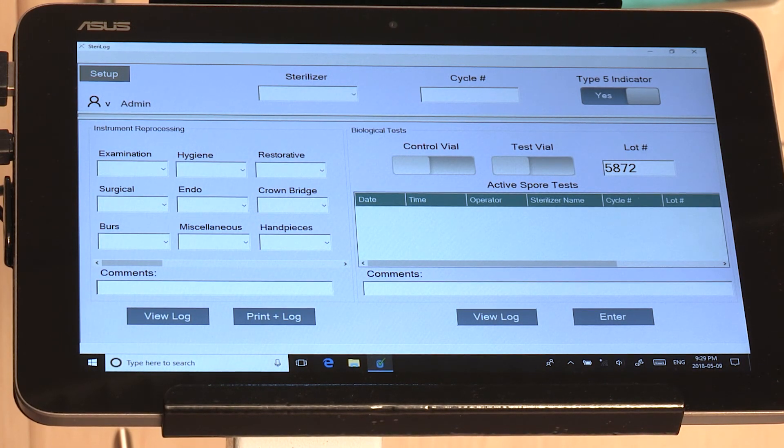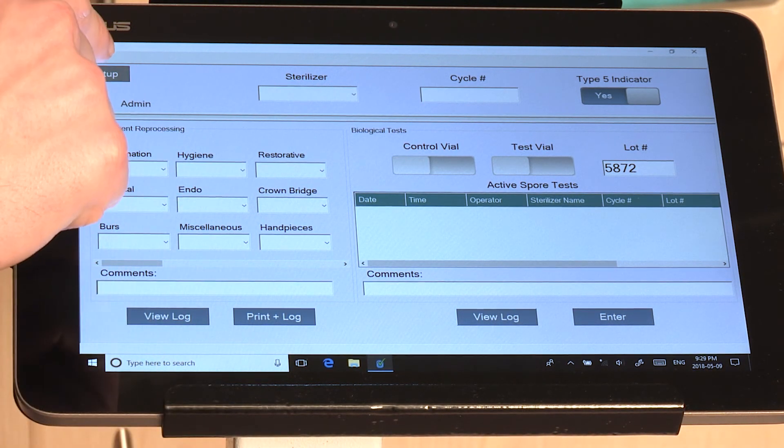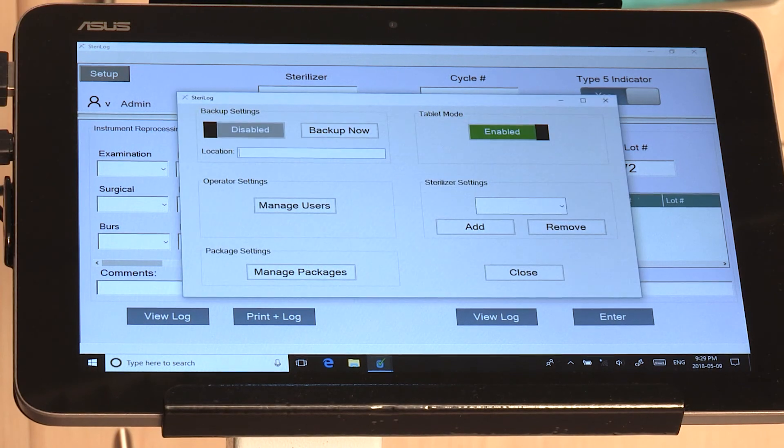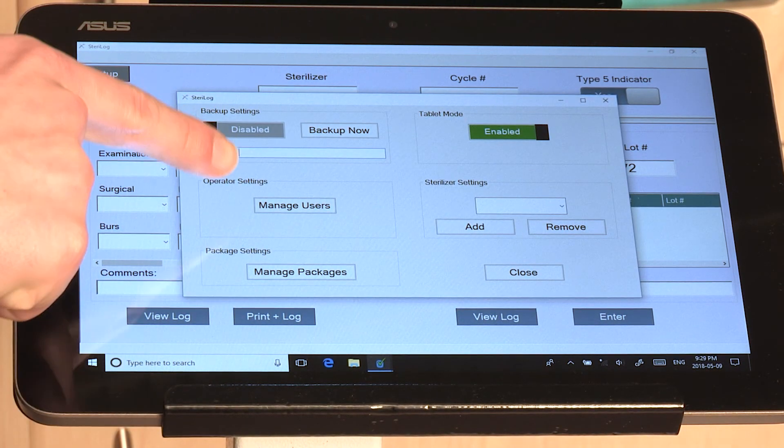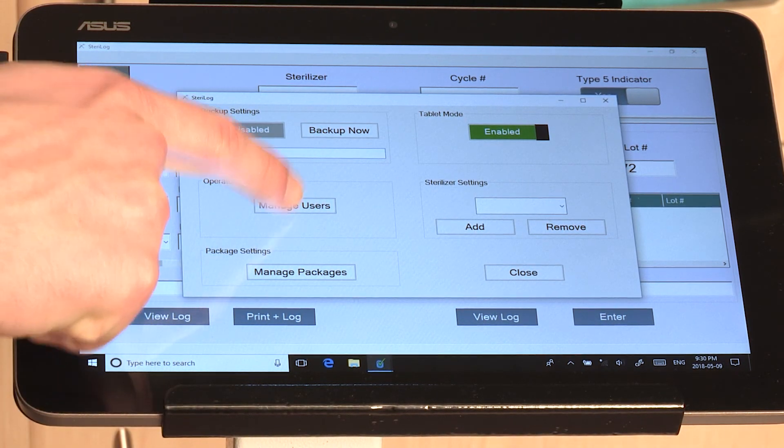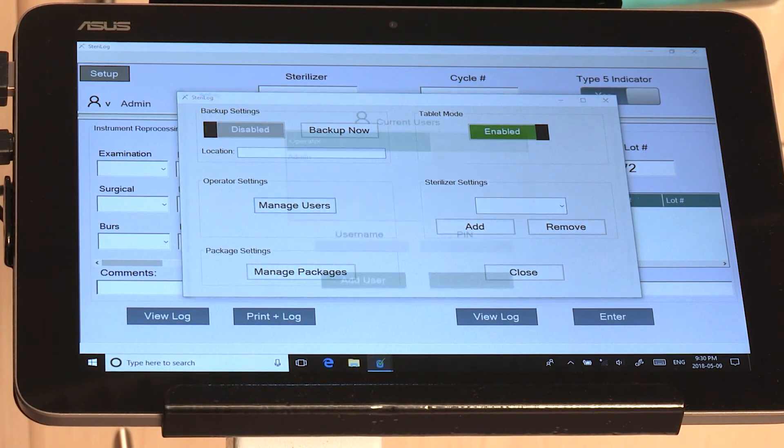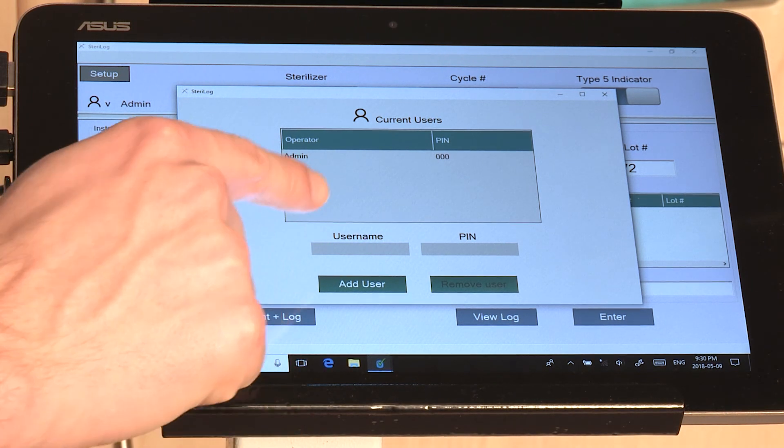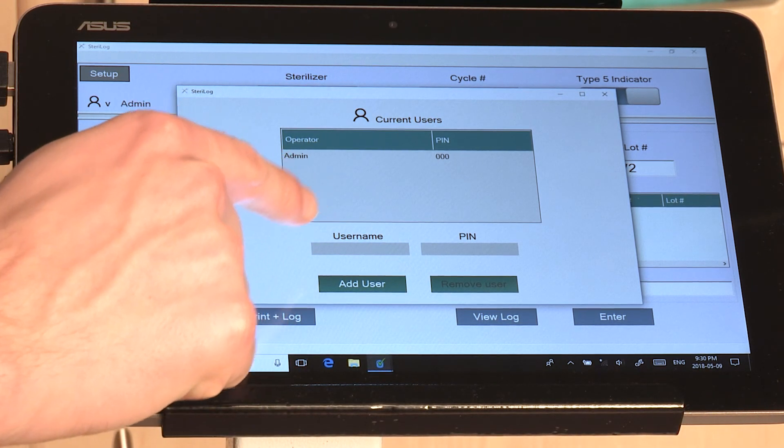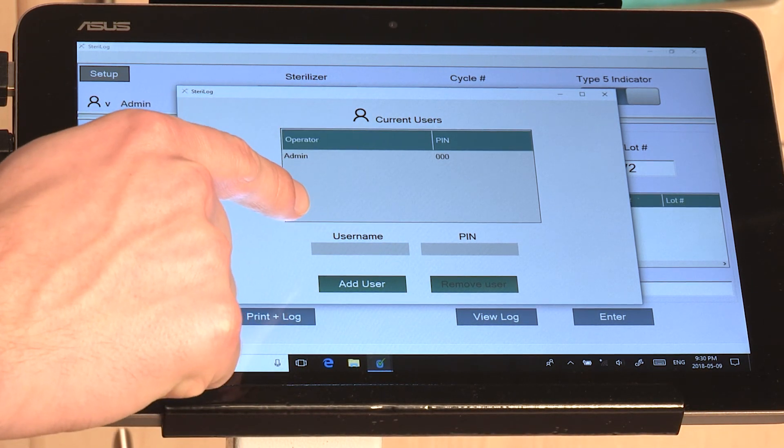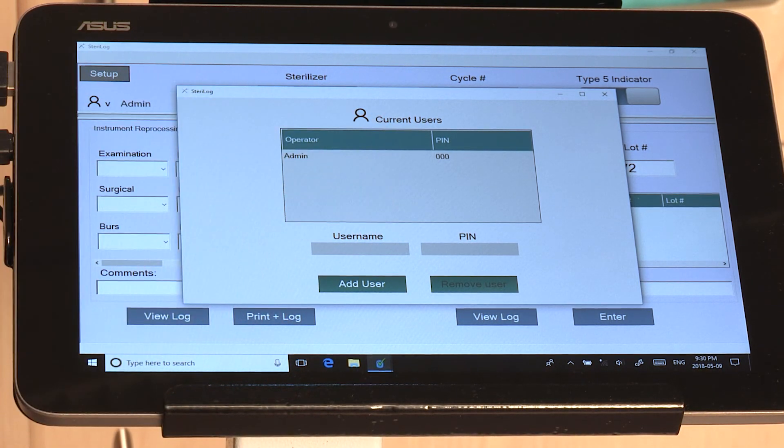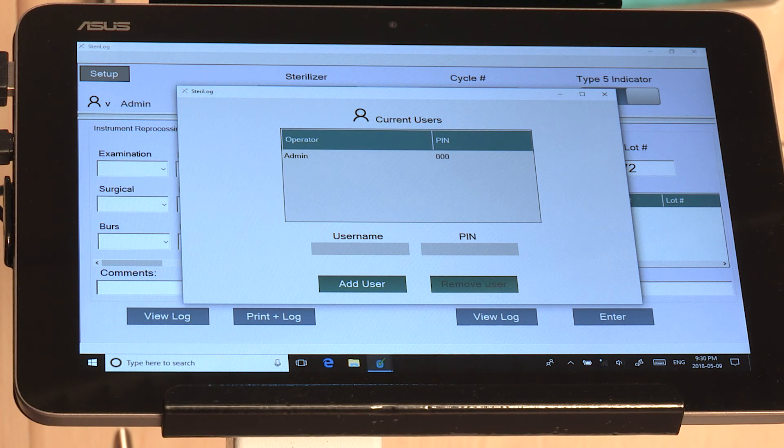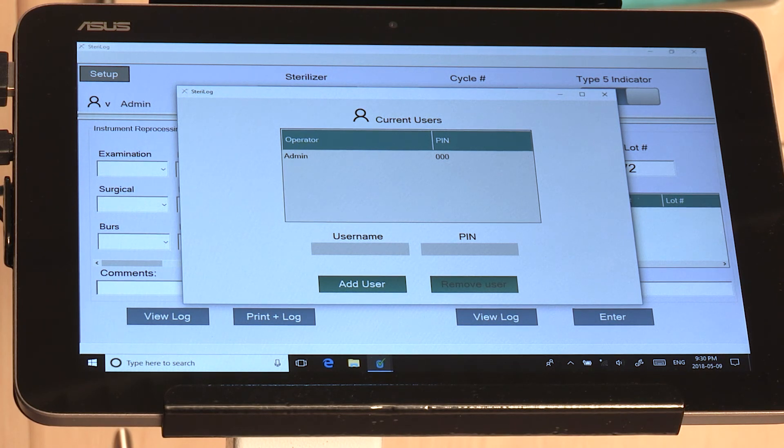You're then going to want to set up some users, so we'll hit Setup and then Manage Users. You'll notice there are two boxes: one for the username and one for PIN. Each of these has to be unique for every one of your users that you set up.